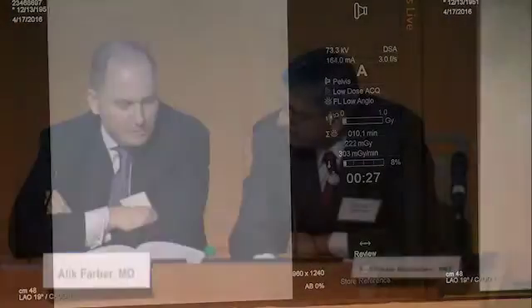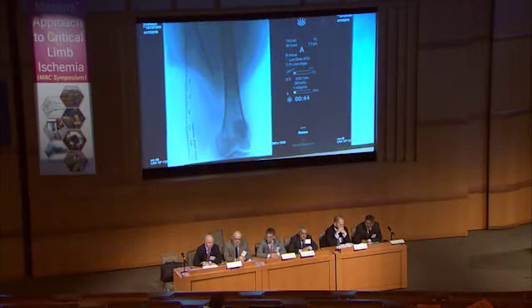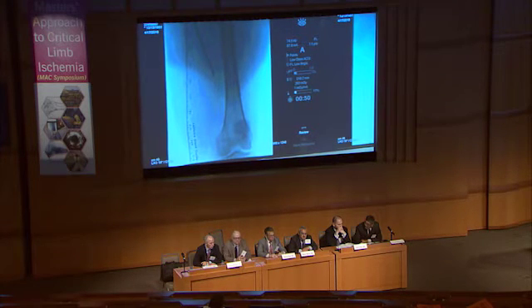That if there are fistulas below the knee, they have an impact on the treatment plan. And Thomas, do you agree with this strategy of occluding the SFA and then taking a picture to make sure that there are no multiple points of communication below the knee? Well, if you would like to identify deep femoral artery areas or branches that contribute to the fistula, then it definitely makes sense.